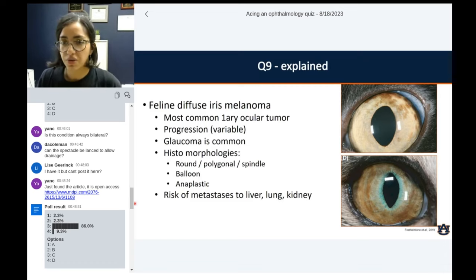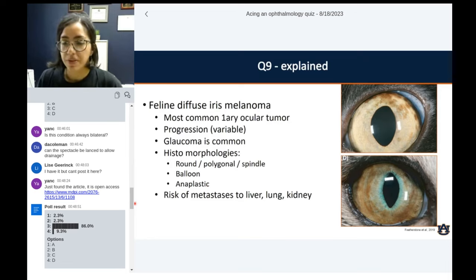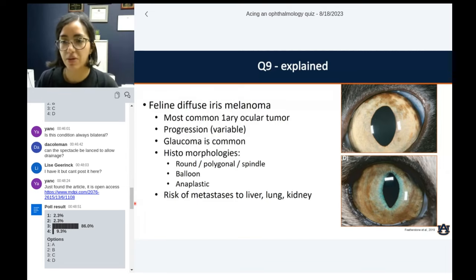You can do immunohistochemistries to help. But if you're familiar with the condition and comfortable recognizing the anaplastic cells with a couple of pigments here and there, that should be your diagnosis straight away. Unfortunately they do carry a risk for metastasis — usually to the liver, but can be in other organs. The metastatic cases are usually those where the eye is completely taken over by neoplasia.